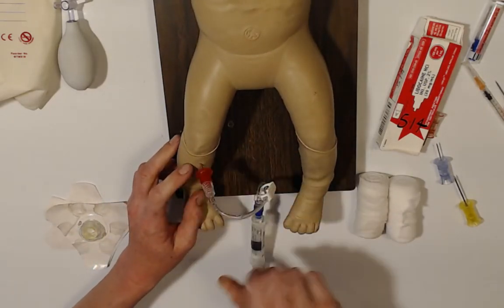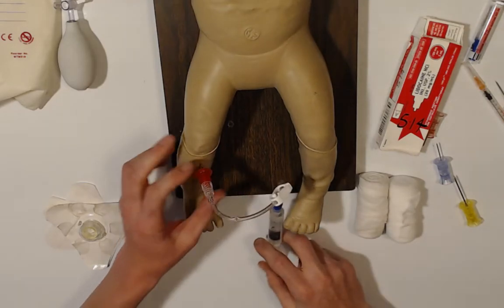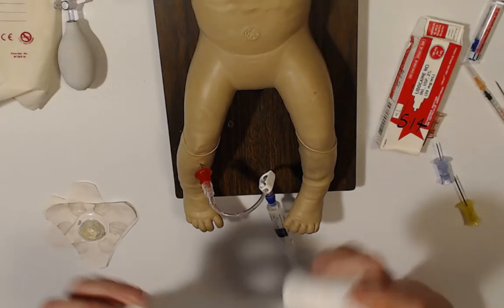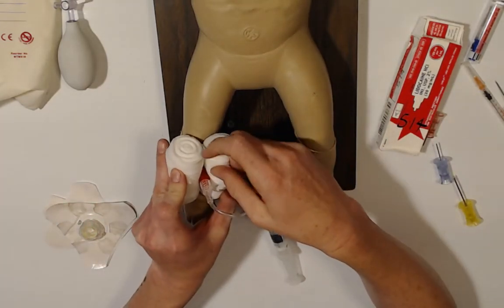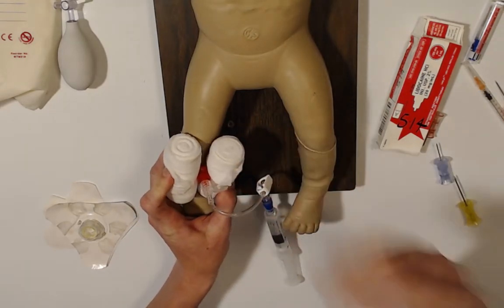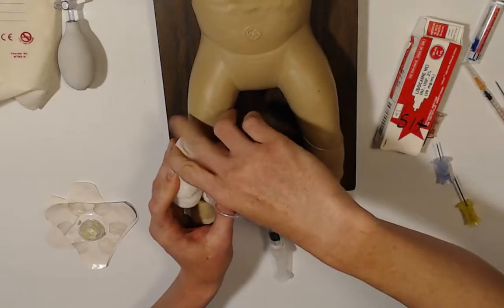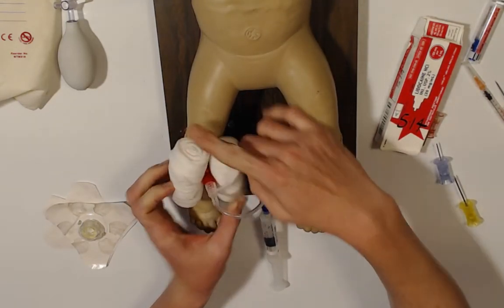So this feels pretty solid. We're going to withdraw. We're going to push a little bit of a fluid bolus in there to make sure it infuses well. And now we're going to have to stabilize. I prefer to use 2 rolls of cling here to kind of sandwich it. And then usually I'd have a partner grab some Coban and help me wrap this thing up nice and tight. Okay, so you can't even see the IO once it's all wrapped up. It's solid.